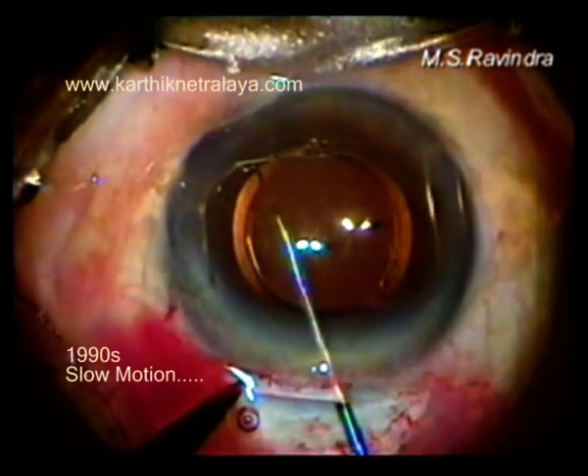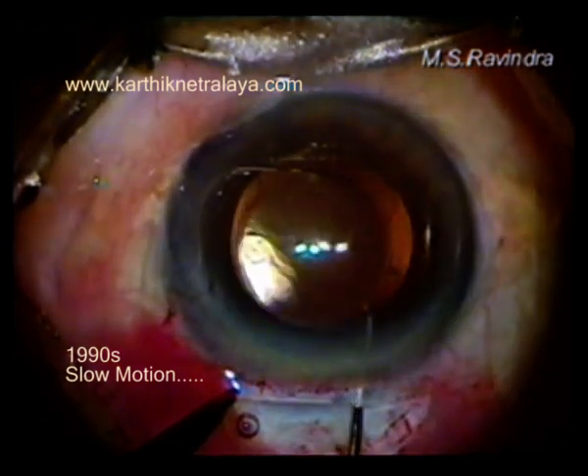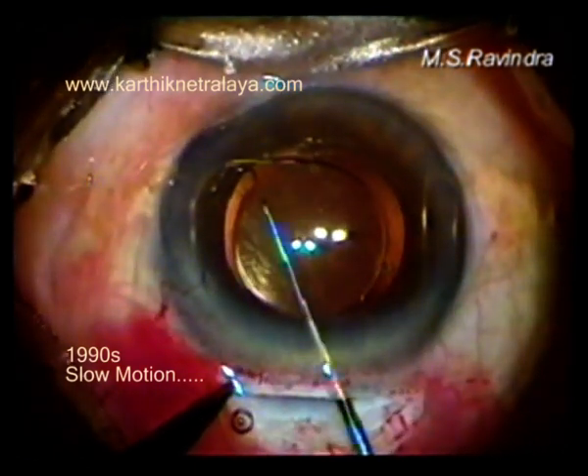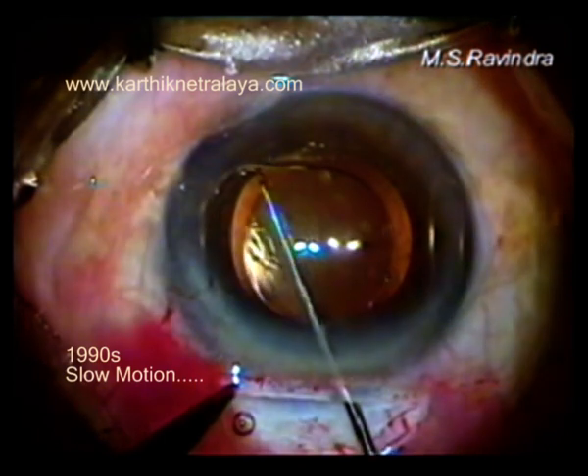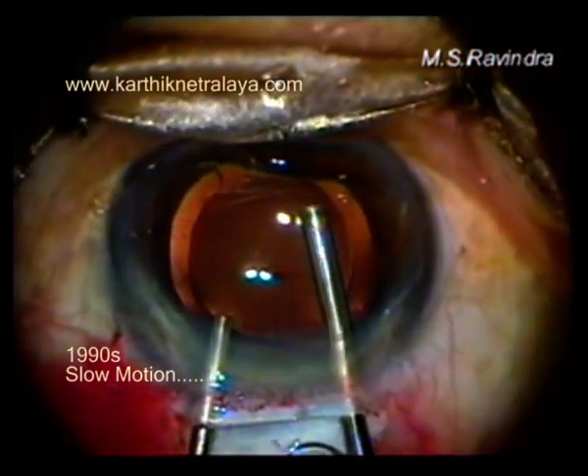I'm checking again with infusion and retracting to see if there are any strands of vitreous. If there are, they are removed. It may be good to have the pupil a little smaller in size, but this also works.